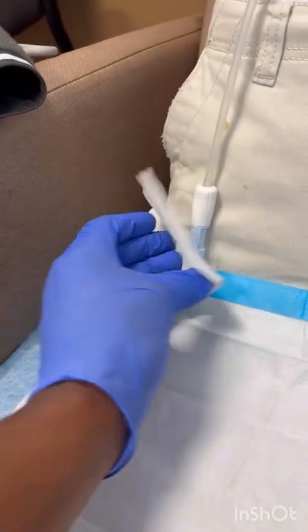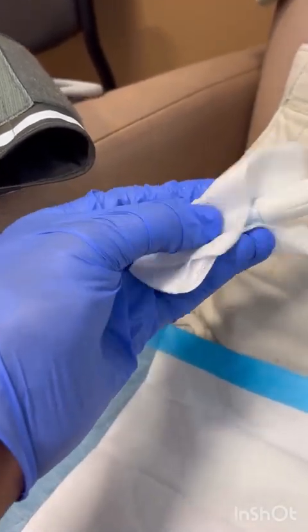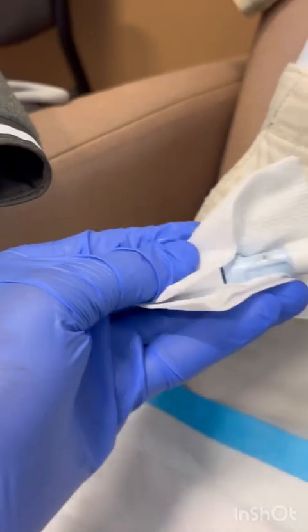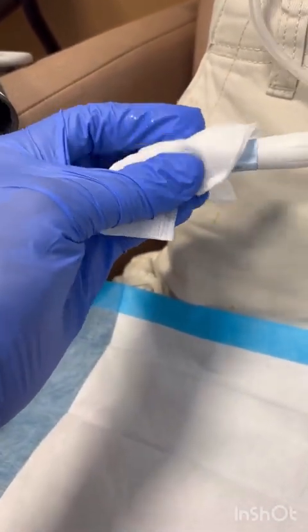Take that first piece and scrub, scrub, scrub for one minute. That is a dirty transfer set, Steve — you really need to clean your transfer set more. Scrub, scrub, scrub for one minute.